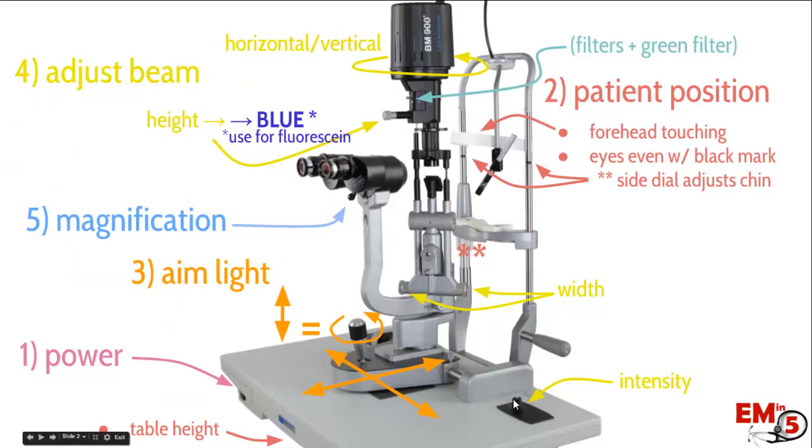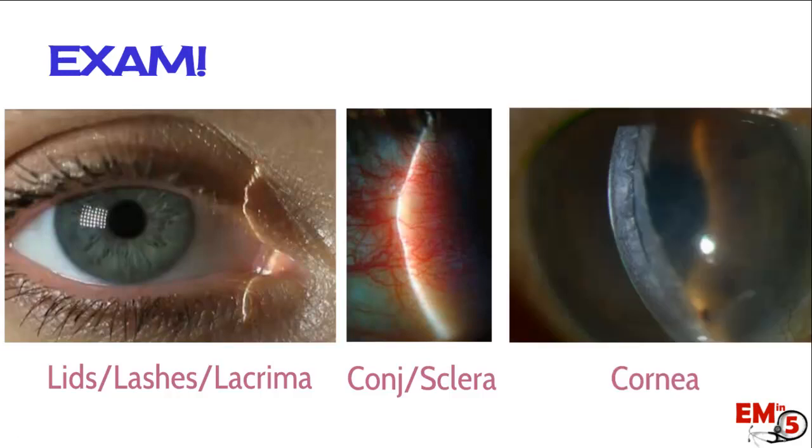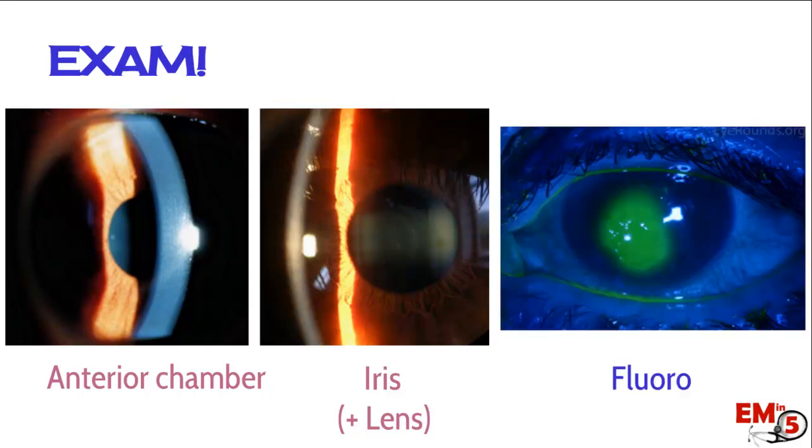Lastly, the beam usually has an intensity dial — on this machine it's down on the table — which makes the light brighter or less bright, helpful if the patient has photophobia. Now it's time for the exam. First, focus in on the lashes and lids. Then move the light slightly forward with the joystick to focus on the conjunctiva and sclera, then scan over to the cornea. From there, move the light 45 degrees to look at the anterior chamber, then move slightly forward until focused on the iris and lens. At that point, use the height dial to switch to cobalt blue light for the fluorescein exam.